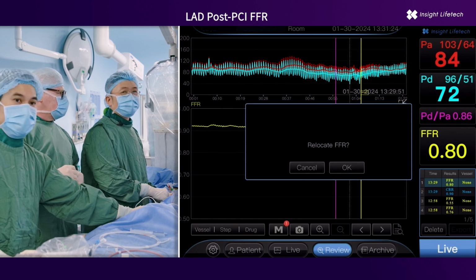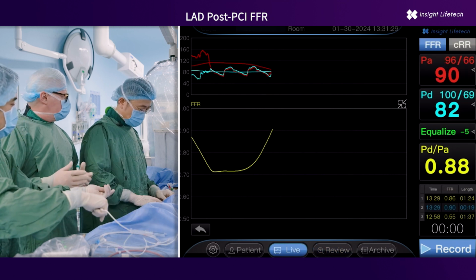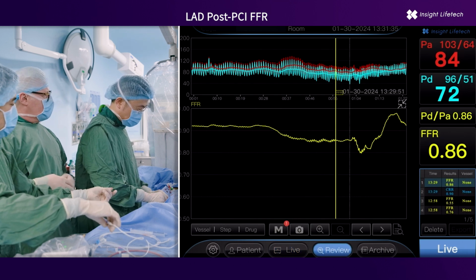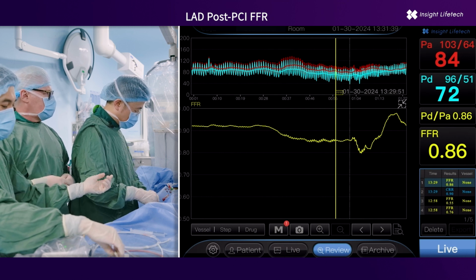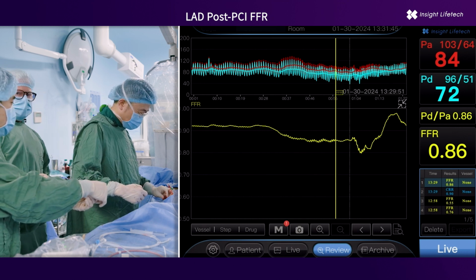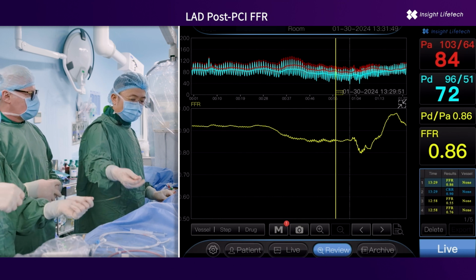And of course, it is also important whether we want to treat this. We need to go for left main stenting. In case of good lumen area, not a very big plaque burden, and only small gradient there, and very good result according to physiology and intravascular imaging, I don't know what is your opinion, but maybe we can just finish this procedure. What do you think? Yes, I will finish.